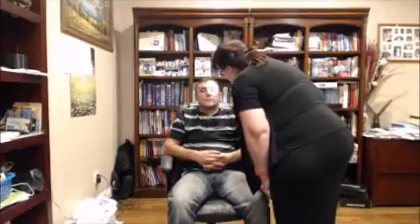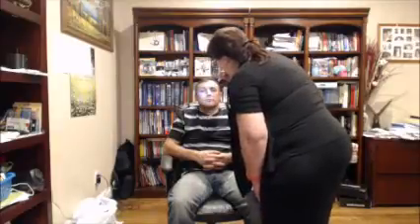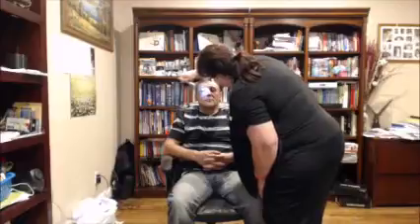So I'm checking the reflection of the light, also pupil reactivity to the light, and also with the oblique lighting, if there are any foreign bodies or uneven discolorations of the eye. Okay, the next one is going to be the exam of the internal eye with the ophthalmoscope.